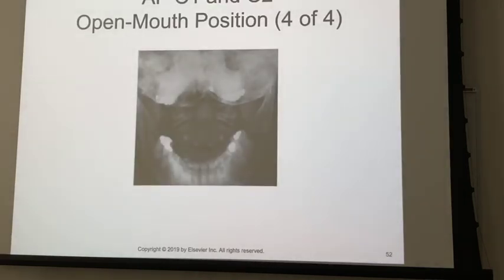So it should look like that. We got lateral masses here and here, so we've got good alignment of the lateral masses, tells us we don't have a Jefferson fracture. We've got not perfect superimposition. The teeth are here, and the base of the skull is here, so we can still see the tip of the odontoid process. If the patient's got a fracture there, it's unlikely to begin with. Again, most of your fractures are going to be down here at the bottom. But if they've got a fracture way up at the top, it's probably not going to be all that big of a deal. So, good open mouth odontoid.